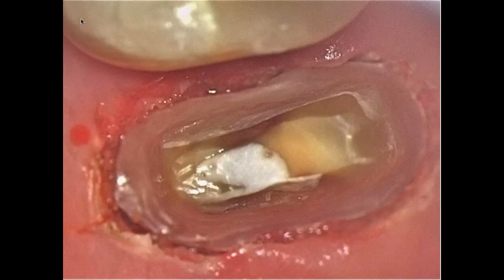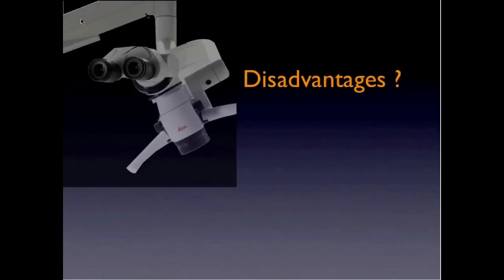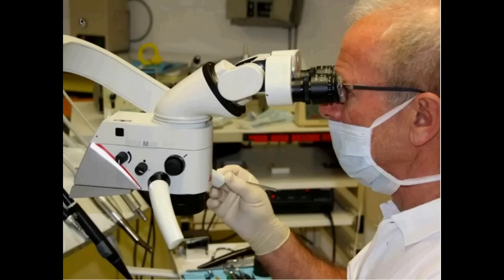So what about the assistants? Can she help you? Does she have to work differently when you work with a microscope, because she needs to give you better support maybe than without a microscope? Well, a different support, because with a microscope, your angle of view is different. It comes from the head. How should I explain it? I'll show you here. You see, can you still see this? Yes. When you're looking through the microscope, you're looking straight ahead, and your view is coming from here.